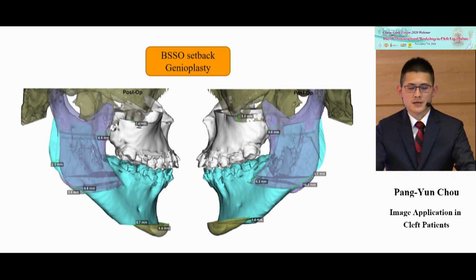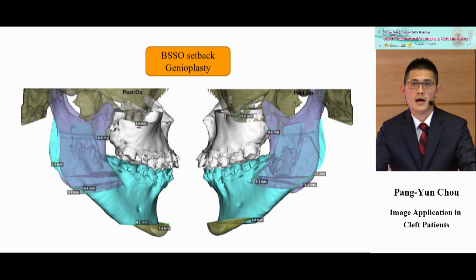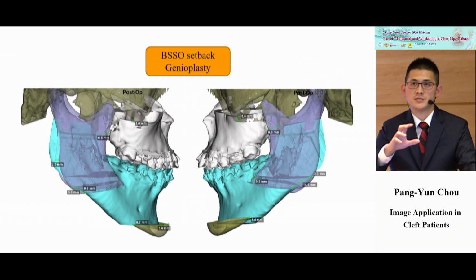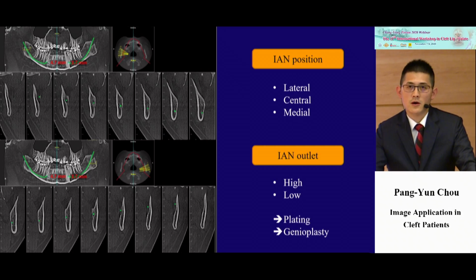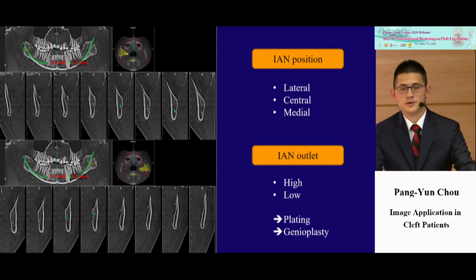And then once turned to the mandible surgery and the bilateral sagittal split osteotomy, how much is the volume of setback could be preliminarily checked, so you can measure whether the final outcome matches your original plan as well. So all this information is now available in our daily practice to do orthognathic surgery.